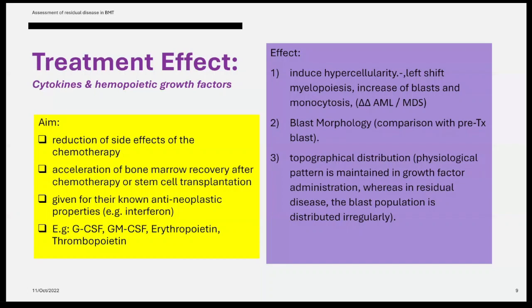This is why confirming with immuno will help you not only to semi-quantify those immature cells, but they will also help to appreciate the pattern, whether they are along the paratrabeculae when we are talking about AML, or they are scattered in between the intertrabecular marrow spaces.